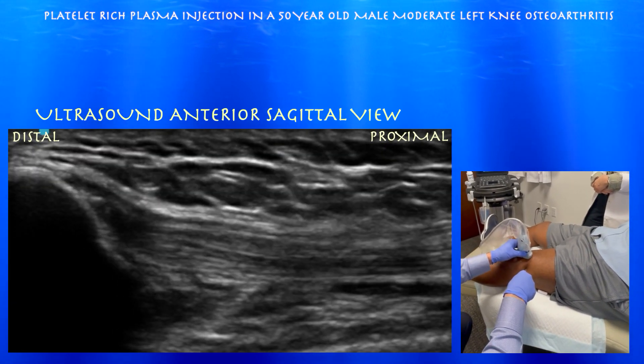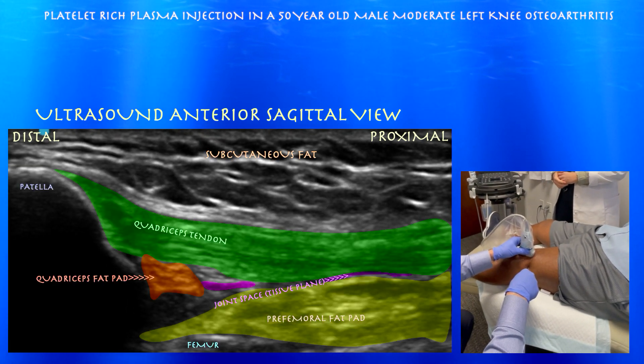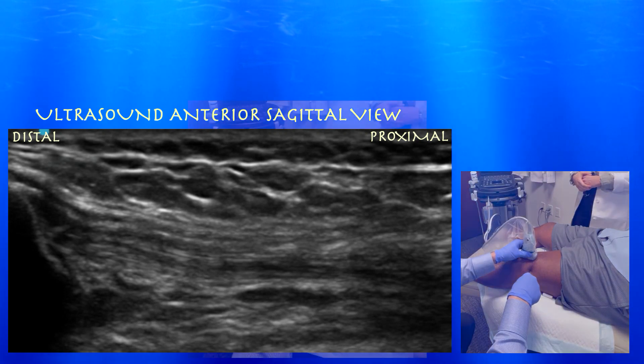Now we're going to look at it from the sagittal plane. Right side is proximal — you can see the patella on the left. There's a little nubby fat pad just under that distal quad tendon. You can see how broad and thick the pre-femoral fat pad is.